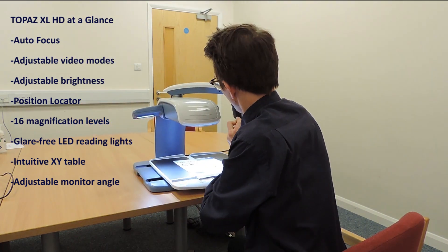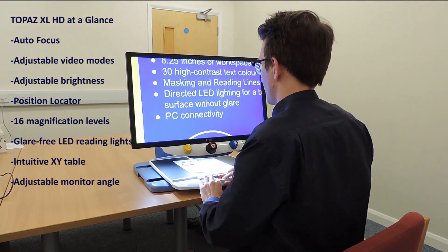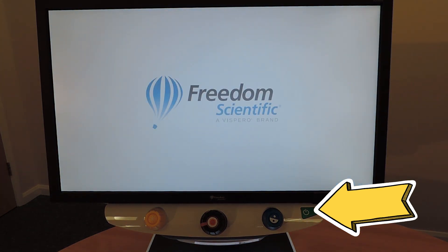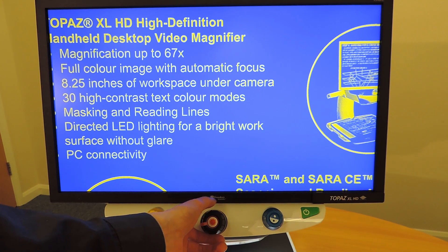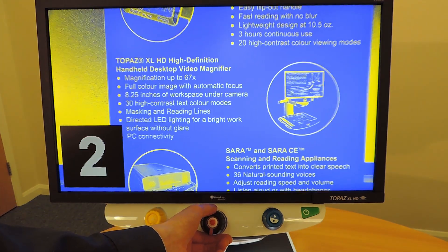This lets you use a lower magnification to maximise the amount of information displayed on the screen, and reduces the need to move the XY table as much when reading text, looking at pictures or working on crafts. Now let's explore some of the Topaz XLHD's features and controls. On the right side of the control panel you'll find the power button — press this to turn the device on. There is also a master power switch located on the right of the camera unit. In the centre we have the magnification dial; turn it clockwise or anti-clockwise for continuous zoom magnification.